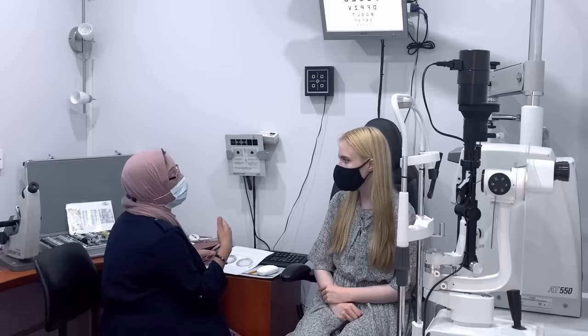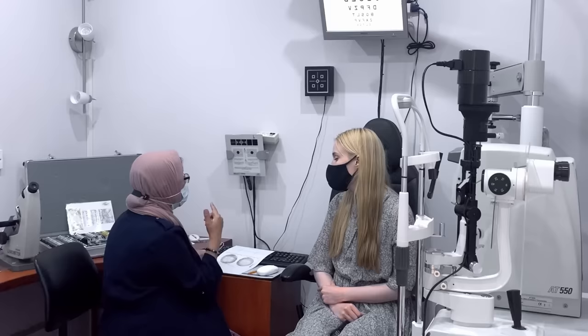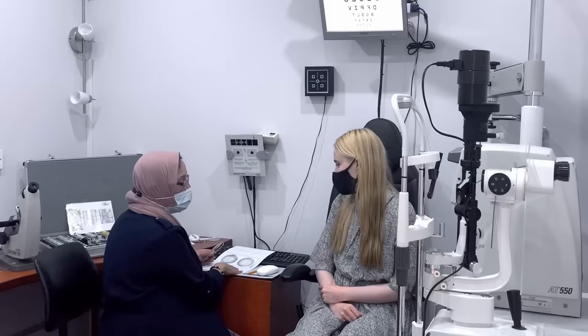Or every couple of years, whenever you decide to come in. Okay. Your visual field has turned out very nice. It's the way your optic nerve sees light as it transfers it to the back of the brain. But just to make sure that even the headaches are nothing sinister, all right? That's proving that the optic nerve is healthy as well. So your visual field was absolutely fine, yeah?